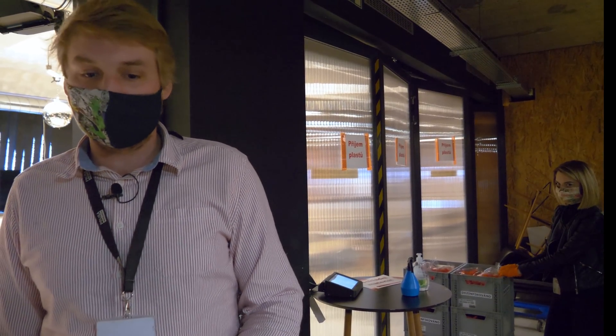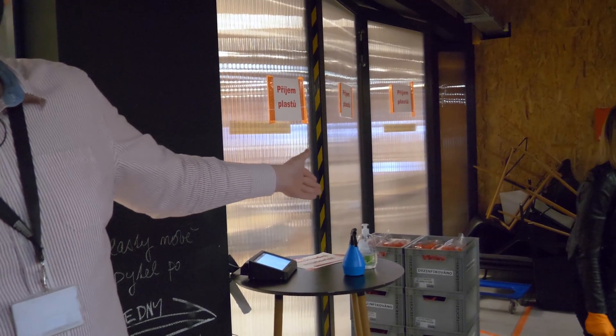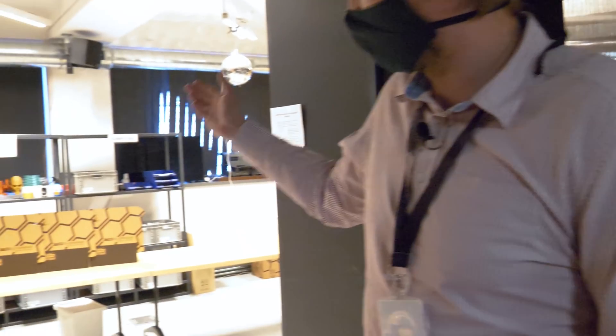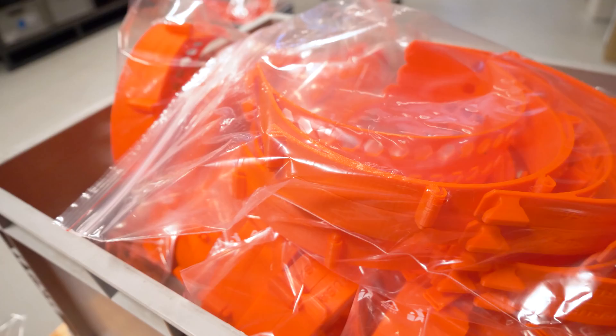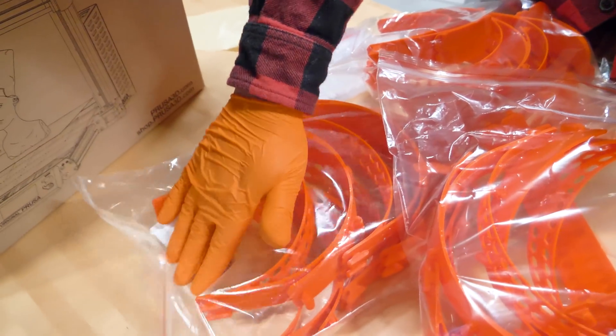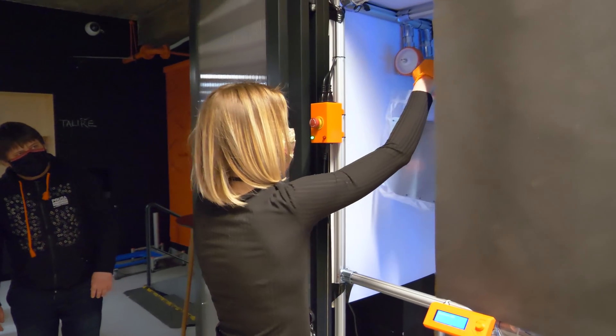Here is the final assembly of protective shields. Printed parts harvested from the print farm are placed here, waiting to be added to the system. Then they're moved to packaging, where they are stacked in boxes with visors and rubber bands. This is another invention of our developers, who made a disinfection line over the weekend.